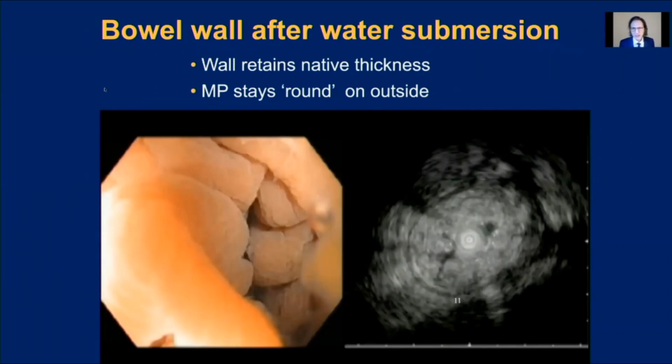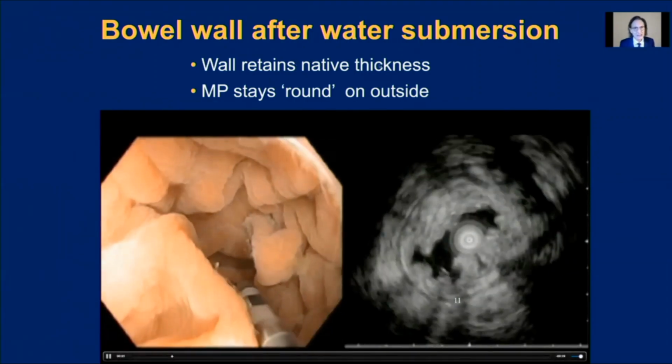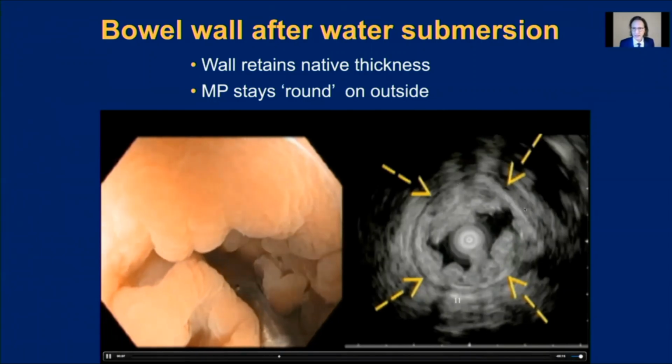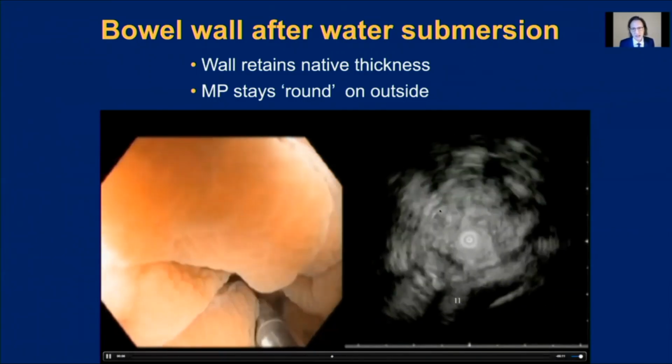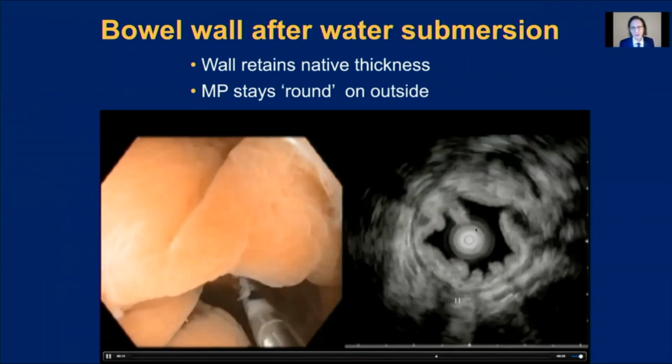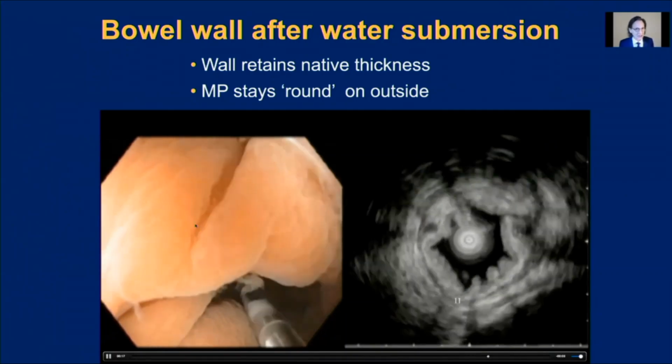It was during one of my routine EUS staging procedures for a growth in the colon that I discovered that when we submerge the colon underwater, and that of course is needed for the acoustic coupling, the wall retains its native thickness and the muscularis propria stays round on the outside. So the MP does not follow the involutions of the mucosa and the submucosa into the lumen. So everything looks contracted here.